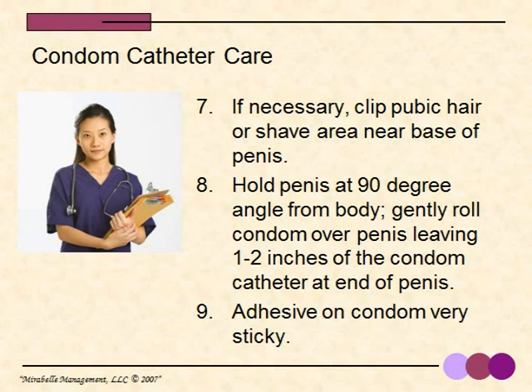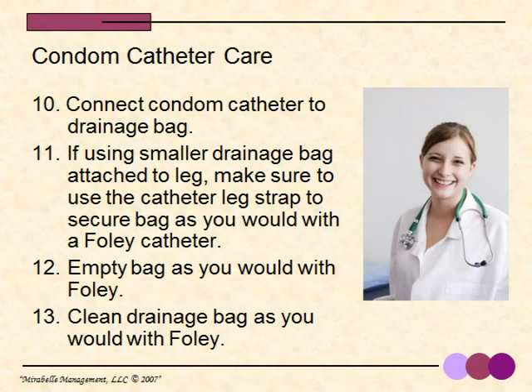I want to caution you that the adhesive that comes on the condoms is very sticky, and it's very easy to get your gloves stuck in this stickiness. The condom can be kept on for 3-4 days, and once it's removed, though, it's disposable and not used again. Connect the condom catheter to the drainage bag.